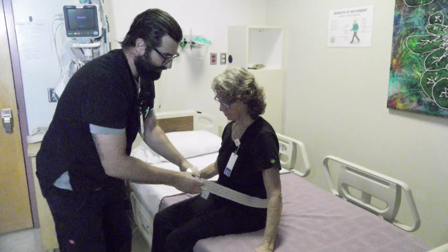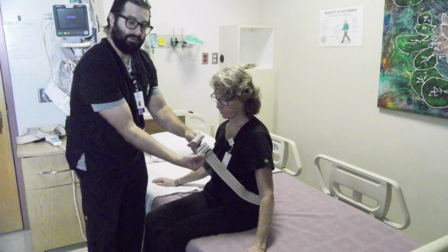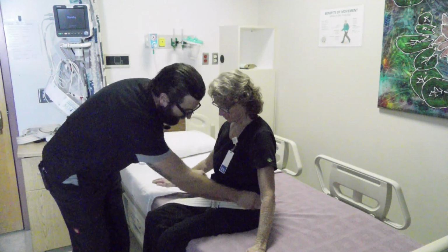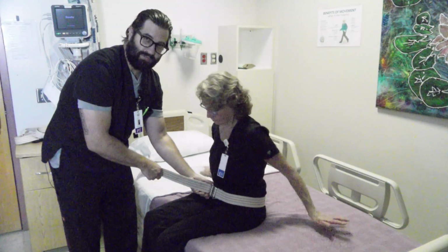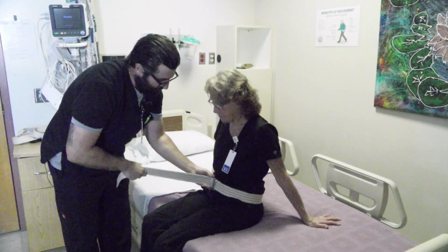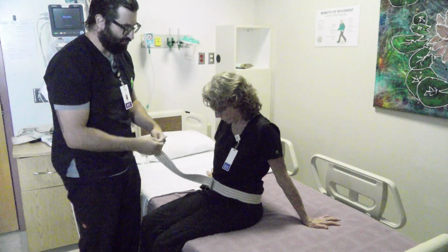And then I've got the teeth side facing the belt. So I'm going to put that through. I'm going to make it nice and snug, and make sure you let your patient know that you're doing this. Say, please let me know. How's that feel, Patty? You feel snug there? Not too uncomfortable? Mm-hmm. Okay. That's good. And then I'm going to slip the other part through the hinge part of the belt.